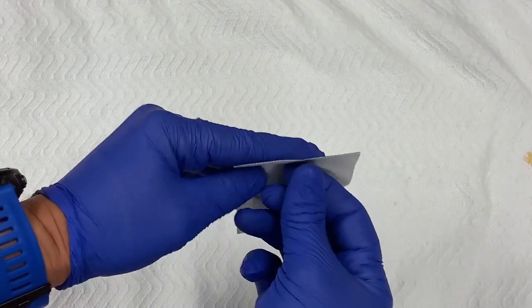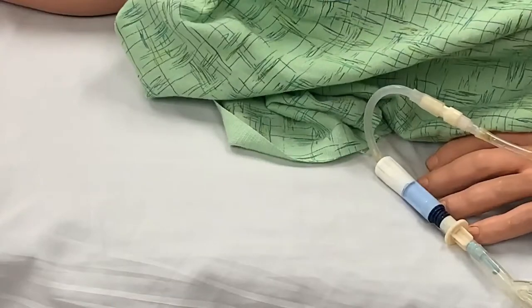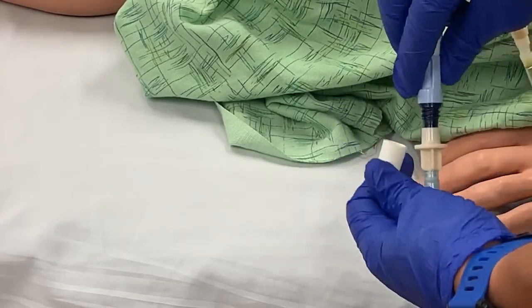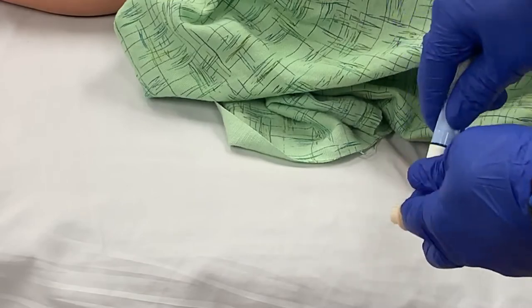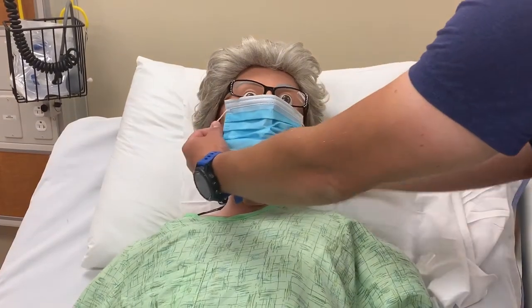Now you'll need to open a brand new Baxter mini cap. Take the patient's transfer clamp, unscrew it from the ultra bag system, ensuring that the clamp opening is always pointing down, and screw it onto the mini cap. With the system closed, everyone can now remove their masks.